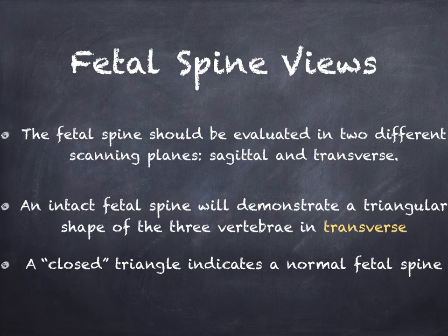Before you begin the exam, be familiar with how the spine looks in sagittal and transverse. In transverse you'll see three ossification centers that make a closed triangle shape. Make sure there's an intact skin line on top of that.